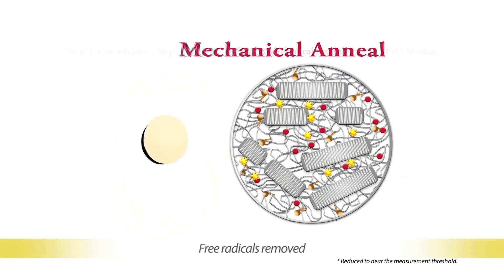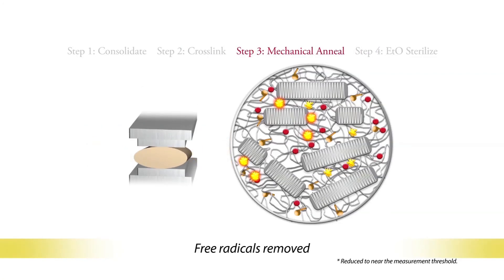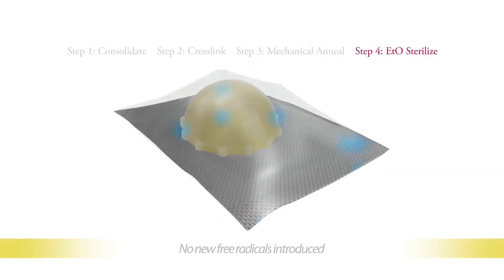Thus, in the third step, the free radicals are removed by applying a compressive force. Unlike melt annealing, this mechanical anneal does not sacrifice material properties such as strength. Finally, after the finished parts are machined, they are ETO sterilized.